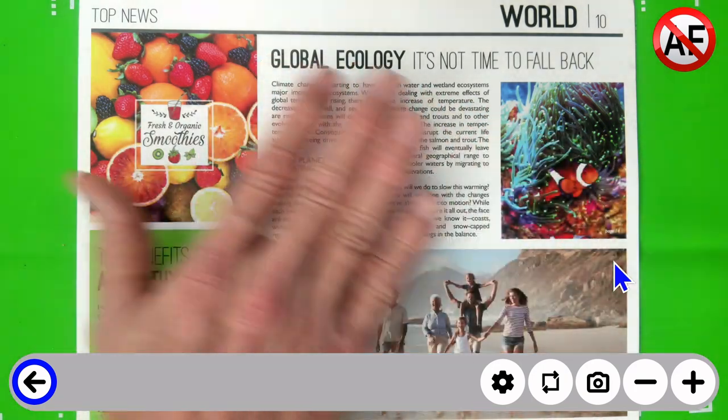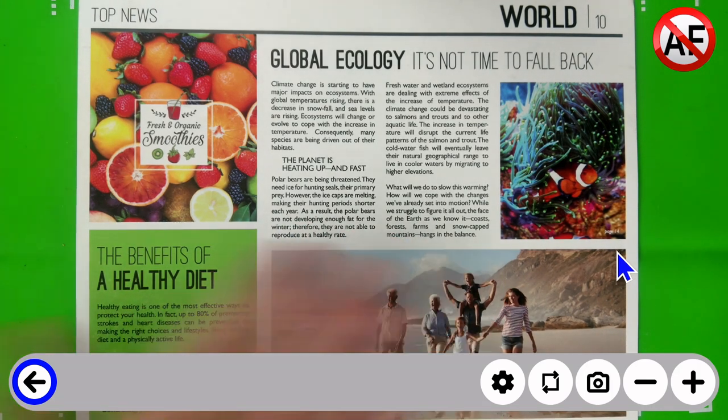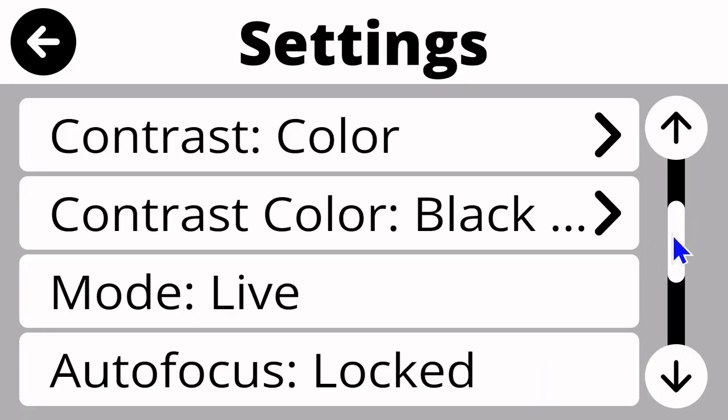Here's my hand moving underneath here, okay? So that is a single page capture, one page document saved to our files, which we will take a look at in just a moment. Let's take a look at one additional setting that we can utilize. Again, I'm in my live mode right now. Let's click on this gear wheel and let's use the scroll bar to scroll down.